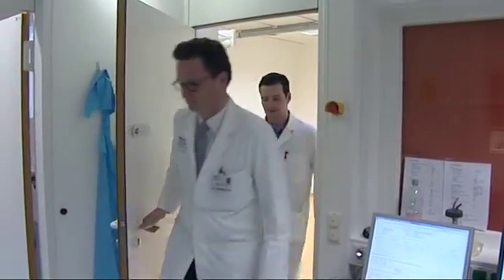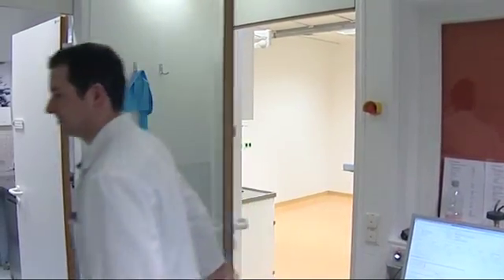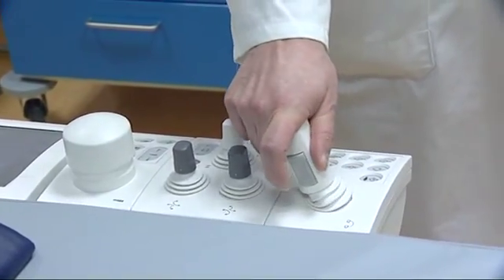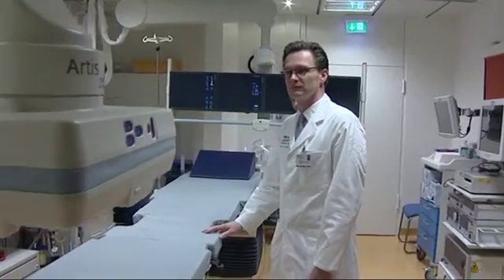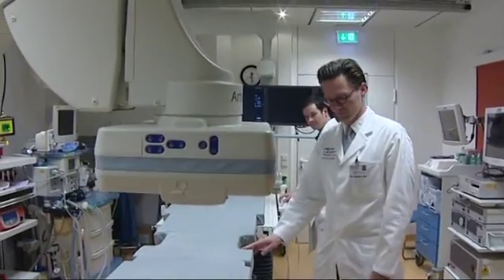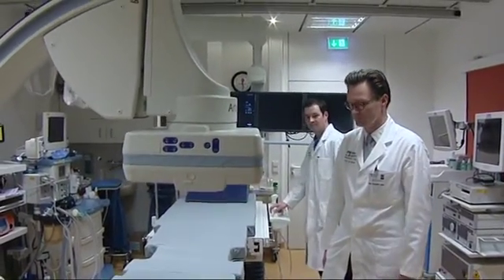Professor Dr. Maurice Stephan-Michel and his colleague Dr. Manuel Ritter often operate with the assistance of the new DynaCT. The director of the University Clinic for Urology in Mannheim regards the 800,000 euros for the C-Arm device as a good investment.